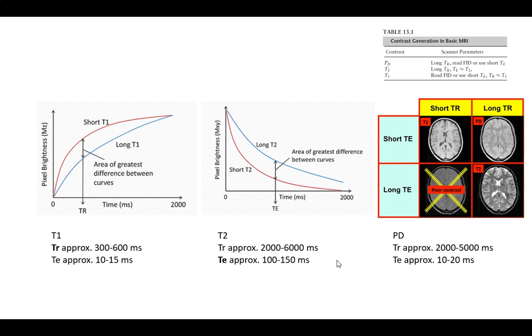All the other ones want the T1 signal gone, which is why they make TR so big. A short TR means you still want that T1 signal existing. Does that make sense why that's picked? I think that graph is probably one of the most useful ones, in my opinion, for making that real.